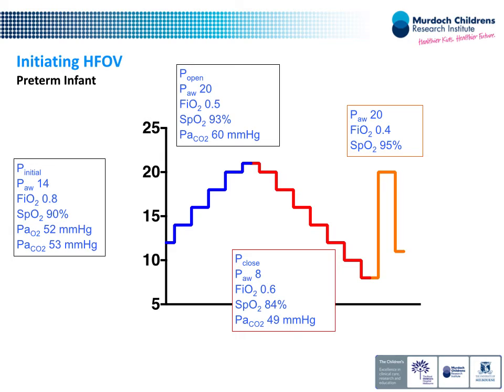Part of what, when we go on to high frequencies, we don't know what the volume state of the lung is. Which is why, as a general rule, when you're on an oscillator and the baby is going bad on you in one way or another, it could be a mechanical thing, but if it is a change in lung mechanics or lung disease, you don't know necessarily if you're overextending or collapsing a lung, because physiologically at the bedside you get the same outcome, drop in oxygenation, rise in CO2 levels. So if you don't know what to do, make a change in your mean airway pressure. Probably the safest change in that case would be to go down first, okay, and then watch what happens and learn. So this is an interactive road, and it requires an understanding of what's going on rather than a cookbook approach.